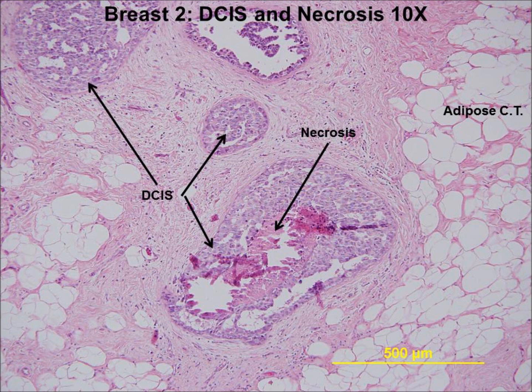That is, the cells have died. As the tumor cells grow and fill the duct, some of the cells in the center become distant from the blood supply and consequently die. That is why you do not see nuclei in this region. They have been replaced by an eosinophilic substance that is hard and often shatters during sectioning.